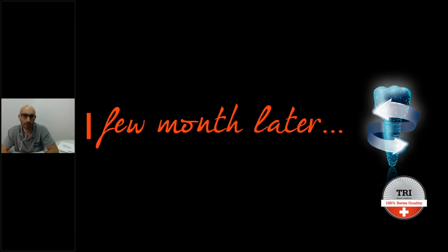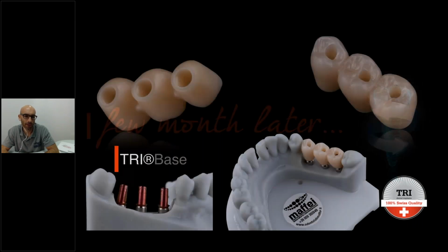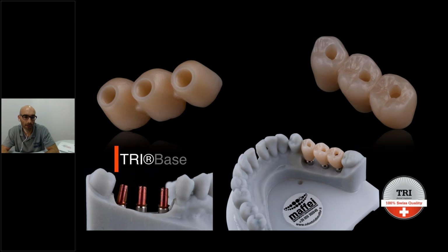A few months later, we do the final restoration. We have just to remill the same file because the doctor said that it worked. We milled the same file again, just with another material, with the definitive material, which was zirconia, in this case monolithic, because it was a posterior area.